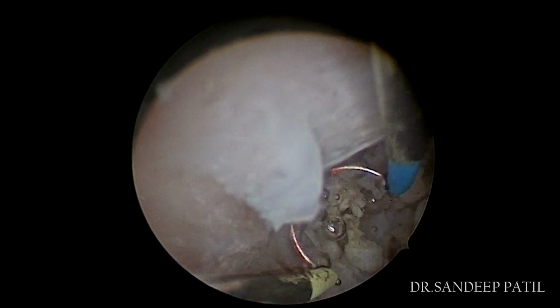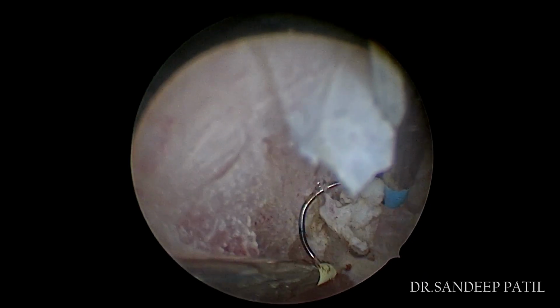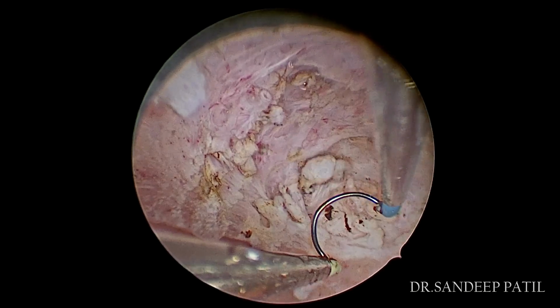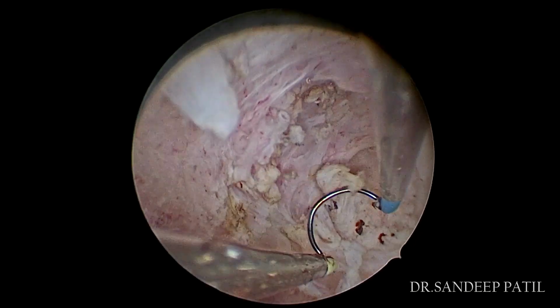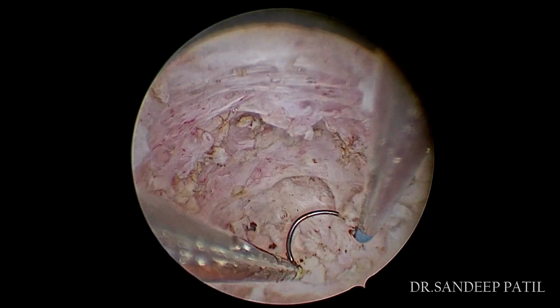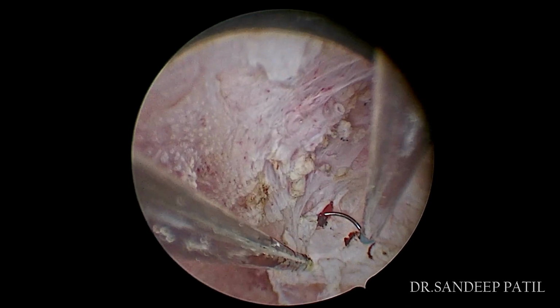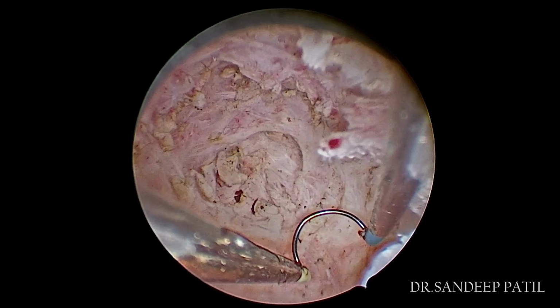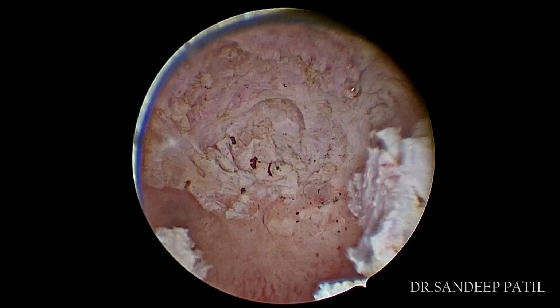Here you can notice the final look of the cavity, and you can see a nice deep crater due to complete resection, while the entire normal cavity is also seen with openings of bilateral fallopian tubes. There is no residual fibroid tissue remaining. Some fibroid beads are seen floating in the cavity, which will come off later on their own.